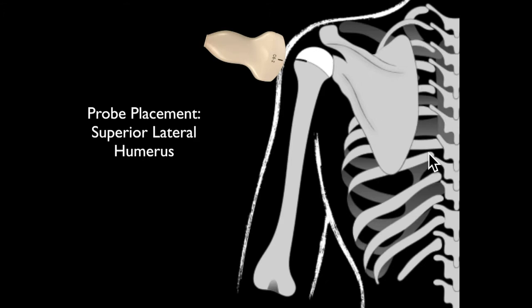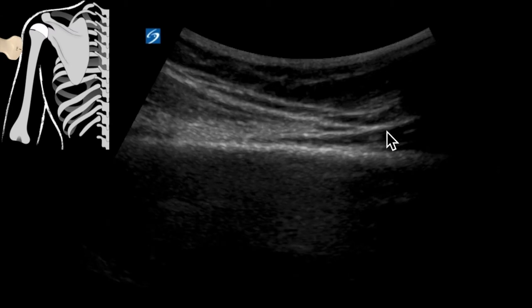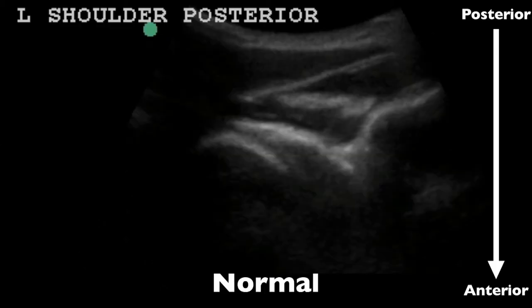Then I like to move the probe over to the superior lateral portion of the humerus. We're going to look for any cortical issues — check the cortex, make sure it looks fine. The humeral head is here; we're going to track that down, make sure it's one continuous line, then drag inferior to get this down. Once again, that allows us to evaluate the proximal third. Doing posterior and lateral should give you an idea of any fractures present, and then we can start evaluating for dislocation and/or fracture.